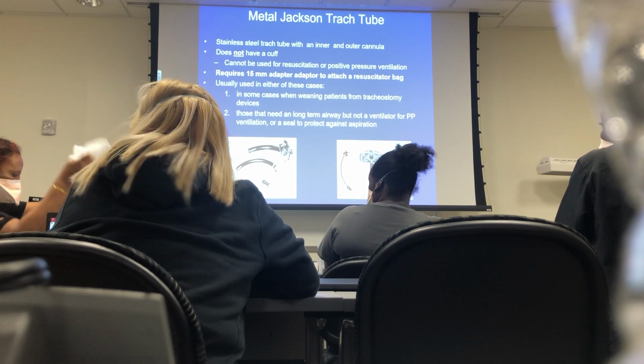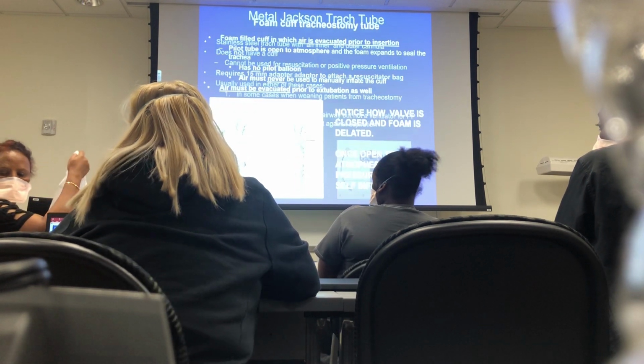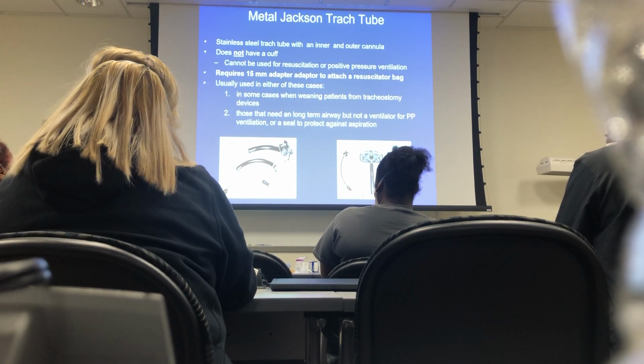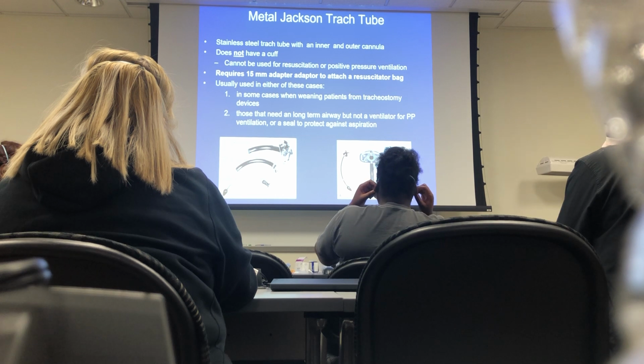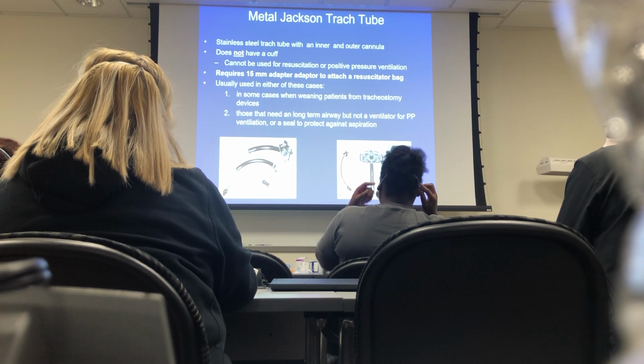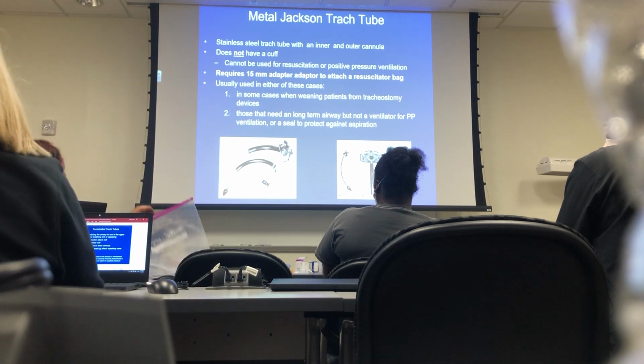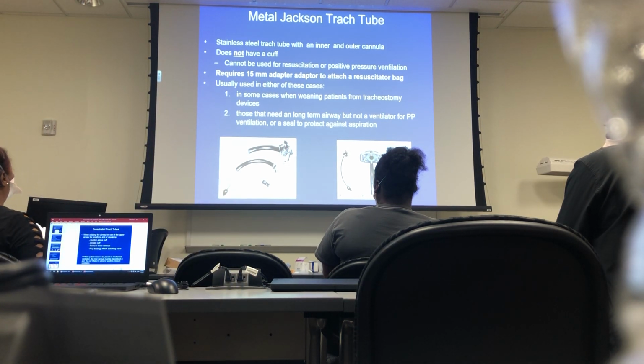Did you guys see what I did? Oh, cuffless, okay? And you need the 15mm adapter. If you're going to bag somebody, that's the little adapter I put in from the outside so that you can connect a bag. And they're used in patients when weaning them from tracheostomy tubes.